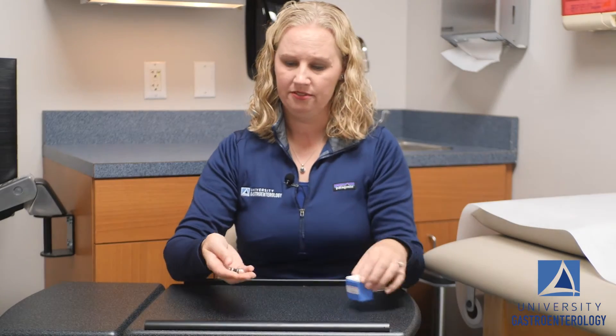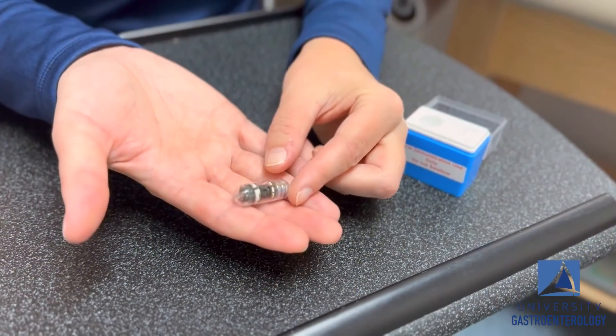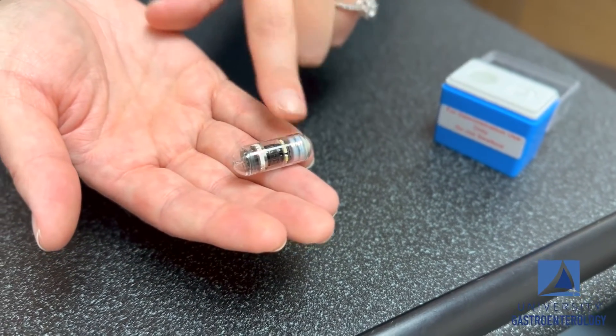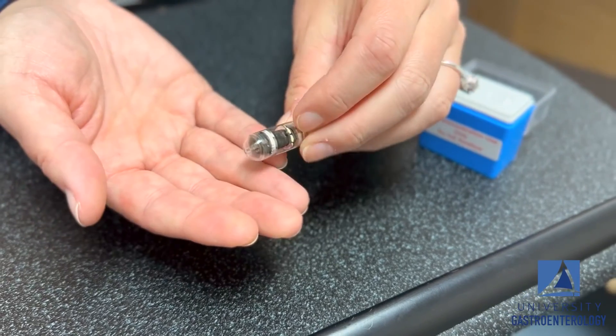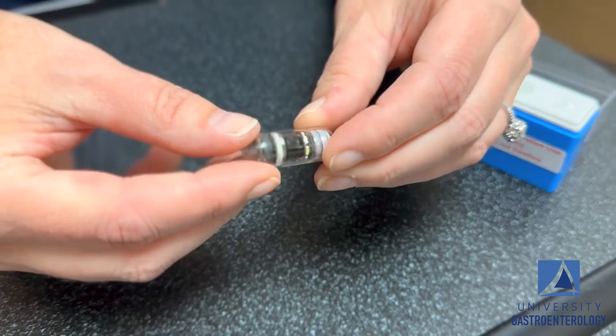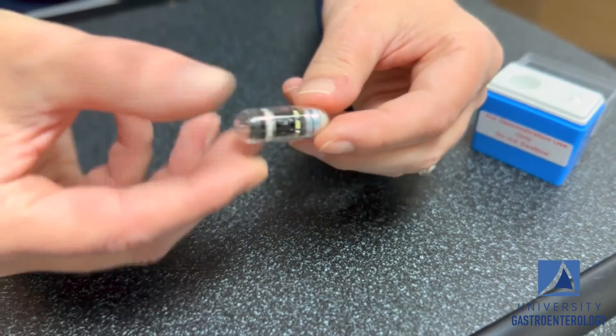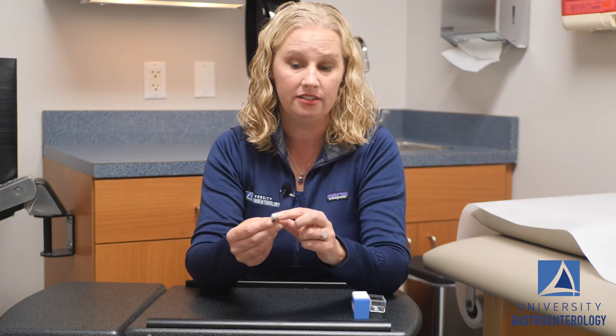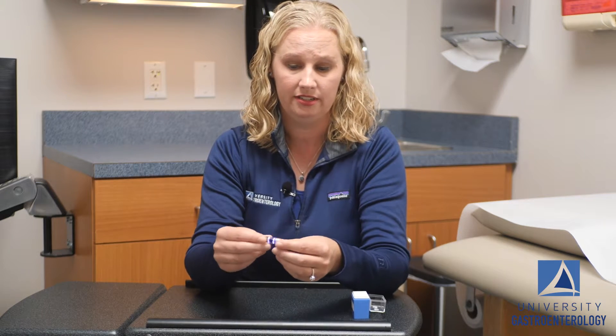This is the capsule. It's about the size of a fish oil pill. It looks worse than it is — it's very smooth, so people don't typically have any issues swallowing it. It has 16 lights and four cameras, so it gives us a 360-degree view of the small intestine. It also has a hard drive in it which stores all of the images, which we later download and review to see what your small intestine has within it.